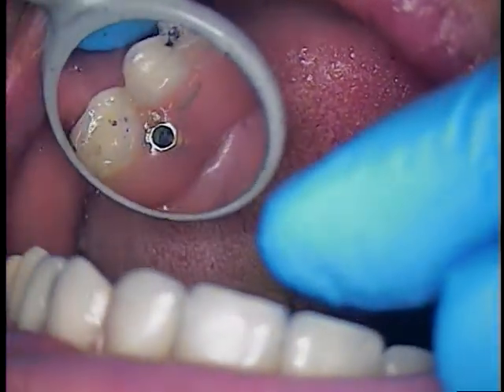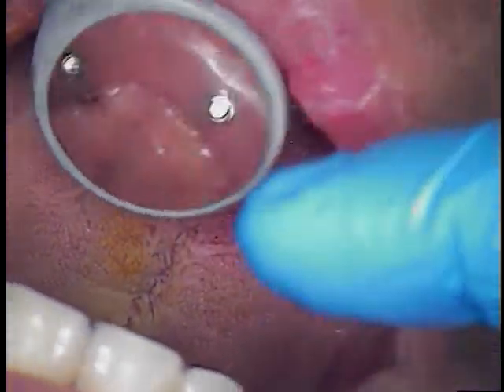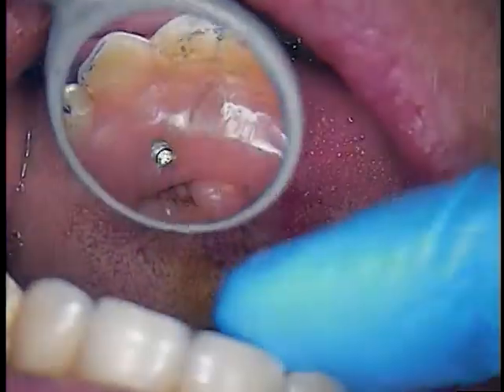All right. And with the occlusion, just as what we covered before, we have contacts on all his posteriors now — that's what we wanted. So we shared distribution between front and back teeth.